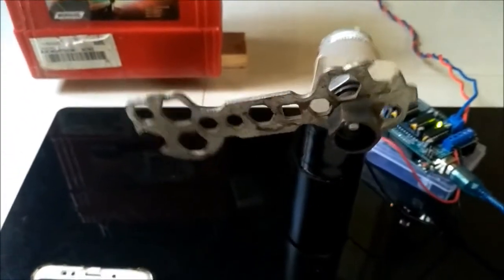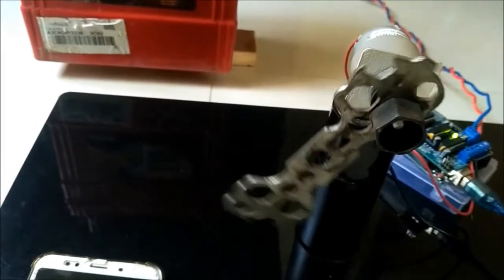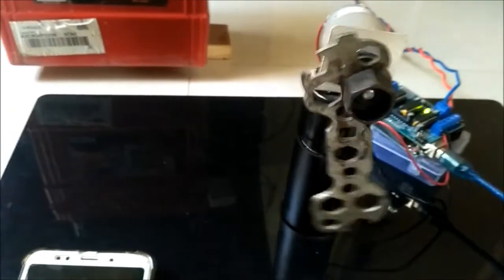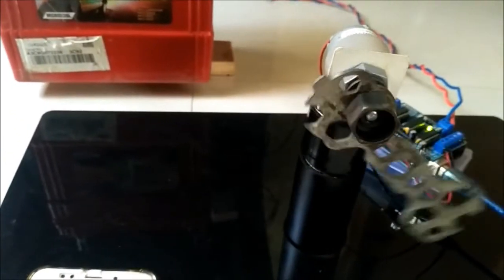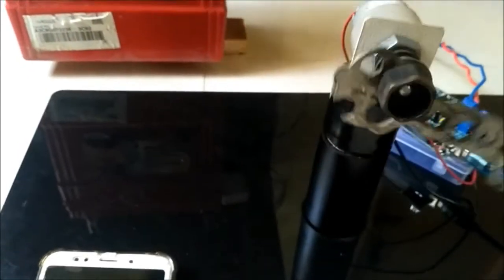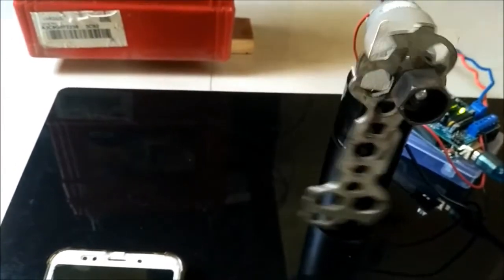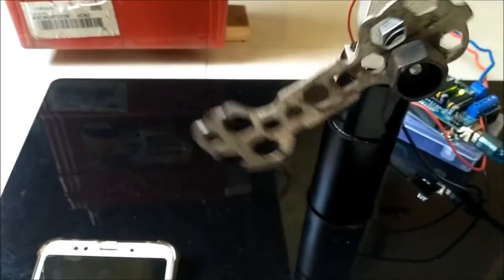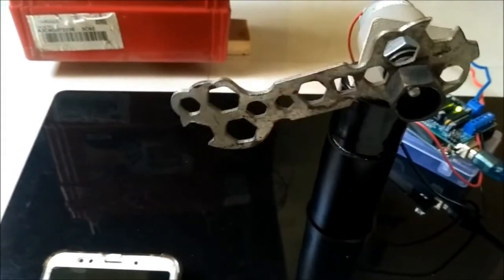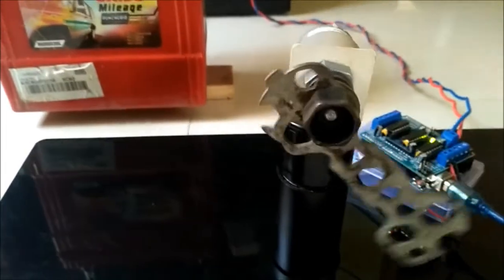This is just a concept. If we develop this into further stages, we can make a robust design to operate this Ambu bag. The different options that can be upgraded here are the motor. Now the motor is a DC motor, it can be converted to a stepper motor, then the arm design, then the setting up, then you can have sensors, flow sensors to control the flow rate of the air that has been drawn out from the Ambu bag, and a display system showing what value of data has to be fed into this microcontroller. Thank you.